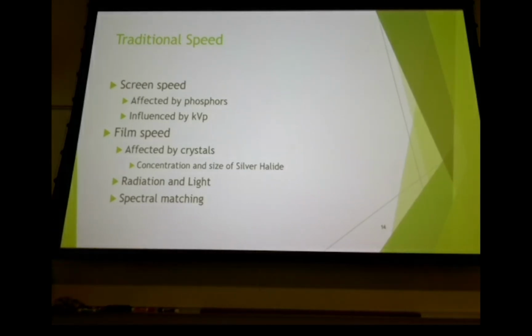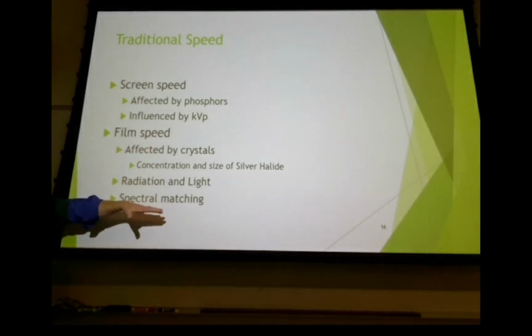Okay, so we had two basic types of films. Kodak made one, and I forget who made the other one. Kodak was sensitive to green light, so the screens would glow green, and the film was sensitive to that green light.